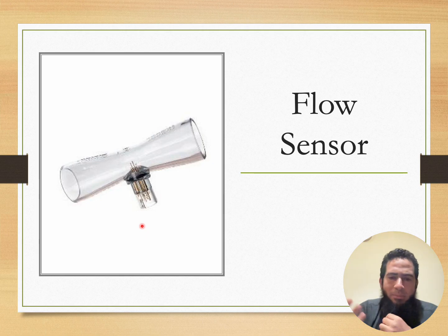That is more related to the ITU team, but who knows? It's necessary to know this. Actually, if the flow sensor is not working, all the modes that contain some interaction between the patient and machine will not be working. Okay, so that's why it's necessary to check the flow curve and to know that.